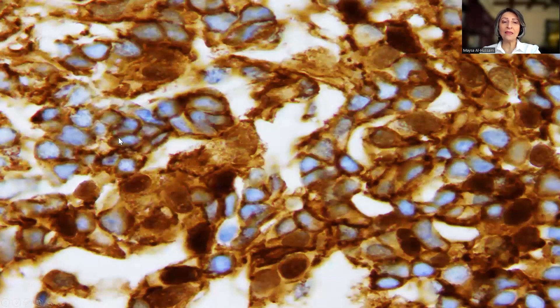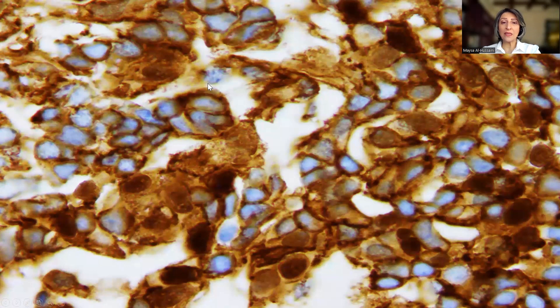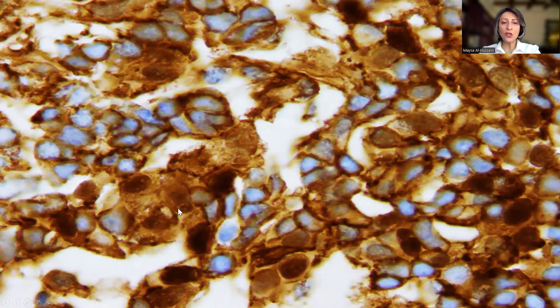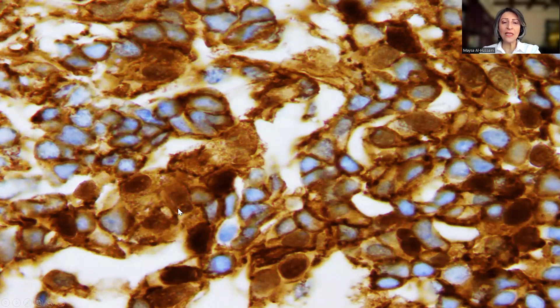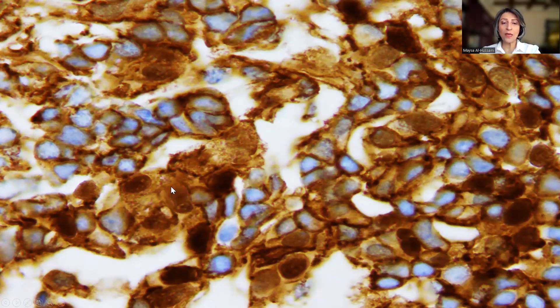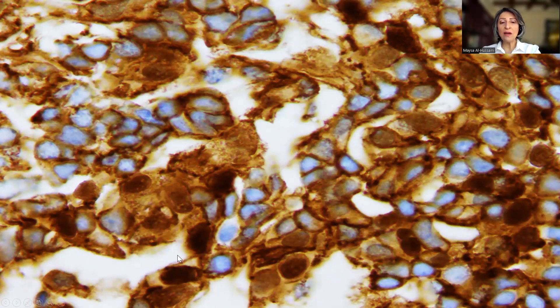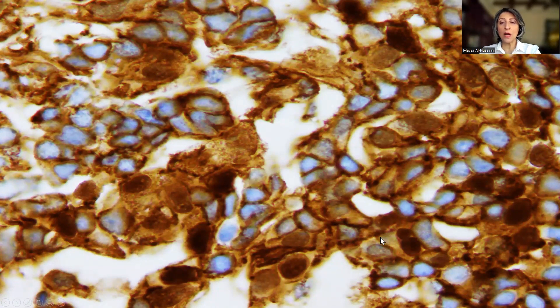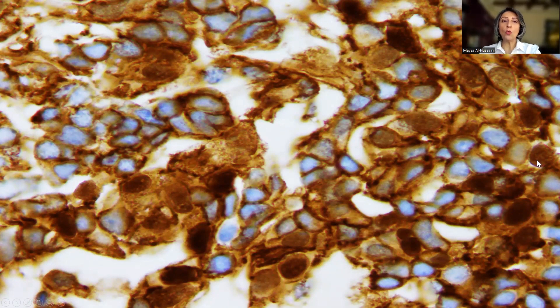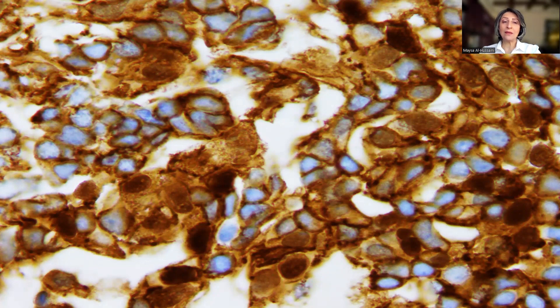Some nuclei are completely negative. Remember that the cytoplasmic membranous staining is normal. Some cells appear as if you cannot really differentiate between the cytoplasm and the nucleus. And then in other cells, the nuclei are dark brown — clearly nuclear stain — which would be supportive of a mutant beta-catenin.